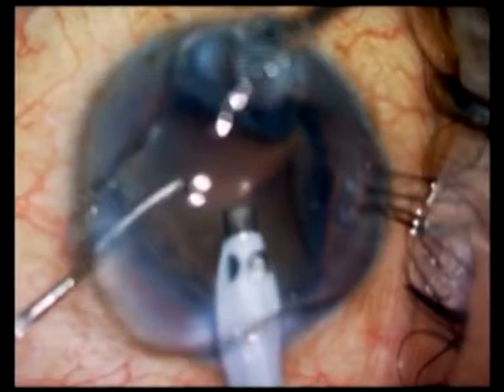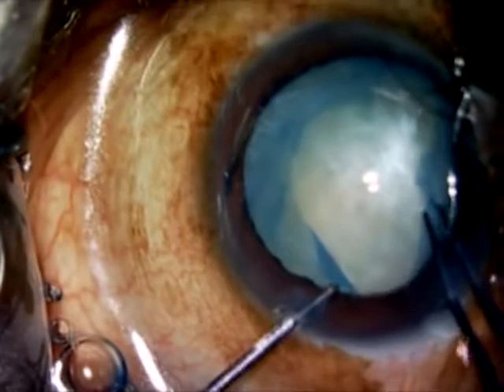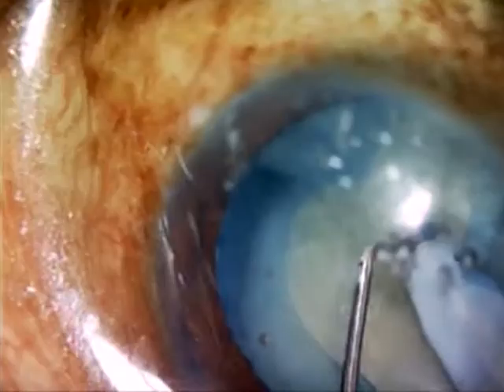Once the Argentina flag sign occurs, phaco can be completed by making a small semicircular rhexis on either side. A direct chop technique called the karate chop is being used in this case.